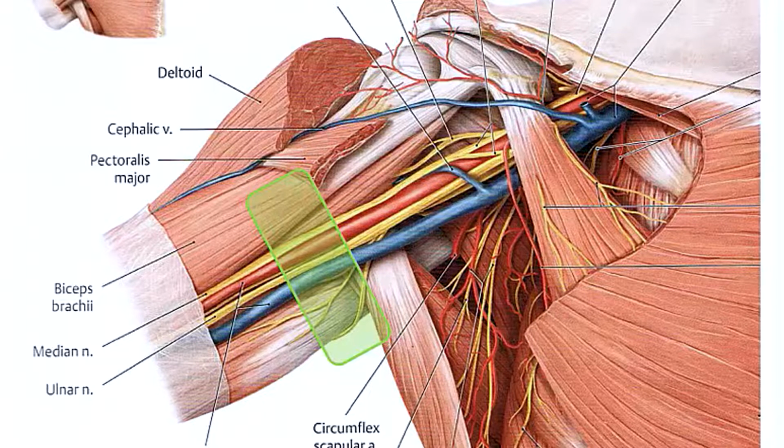So block the musculocutaneous, because it will improve the surgical conditions of an axillary block, whether that block is important for the surgery itself or not. So start with the musculocutaneous. But the image that I wanted to show you is the image of the conjoint tendon.